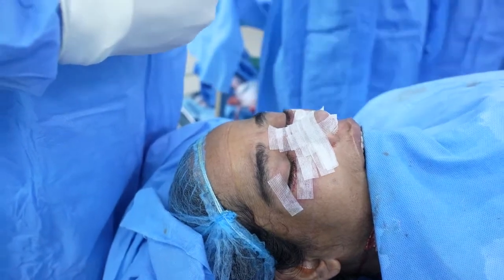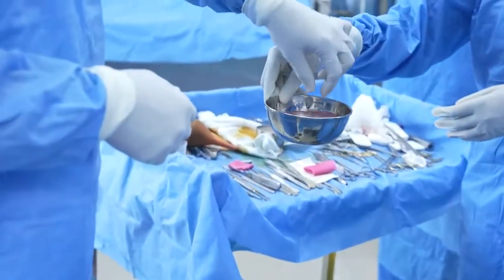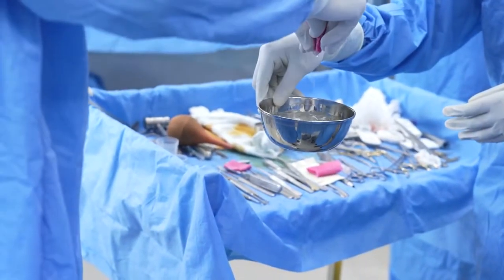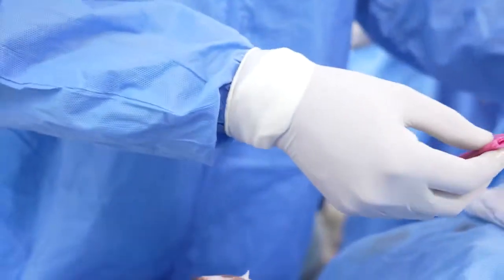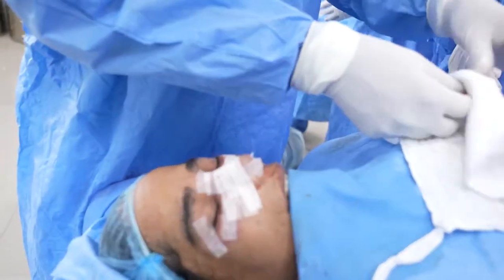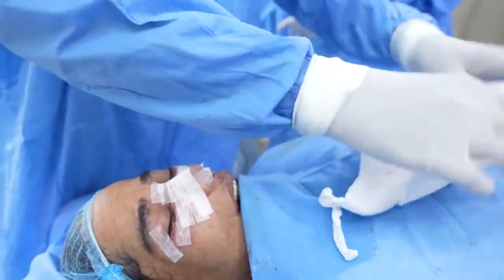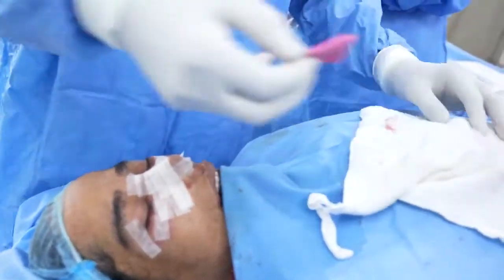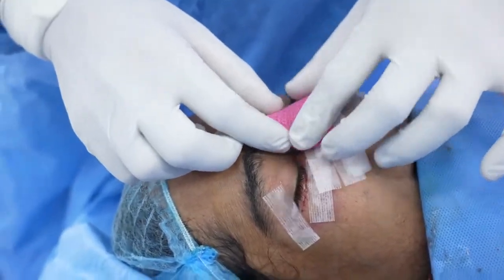Then we will put this in hot water, which is what I'm doing now. You can see me dipping. Then we take a gauze, a mop. We wrap this around just for a while, just to take off the moisture, make it dry. When that's done, then we have to adapt it.